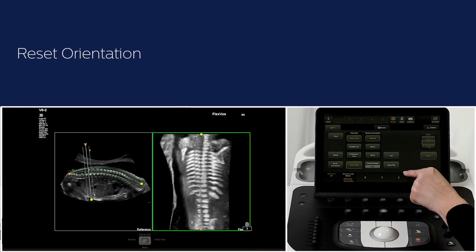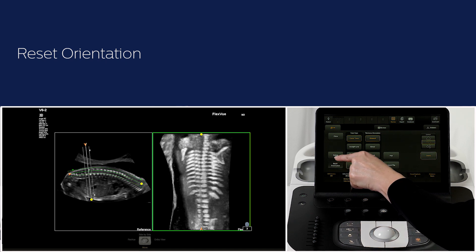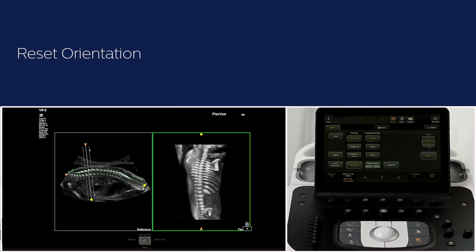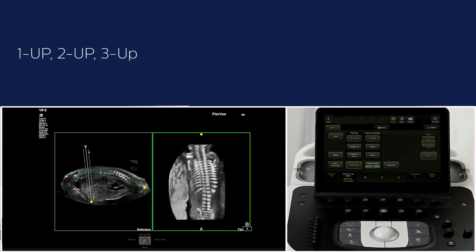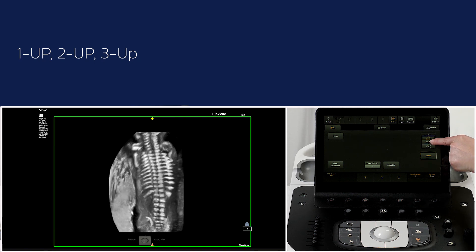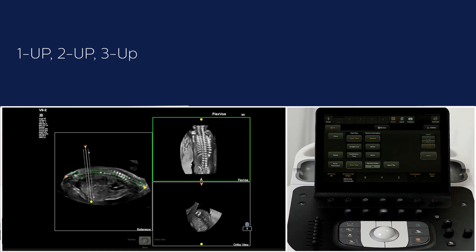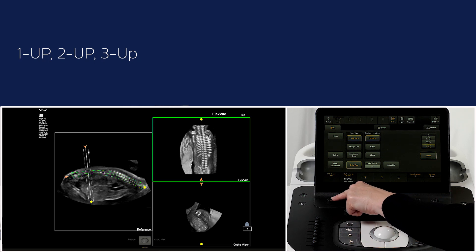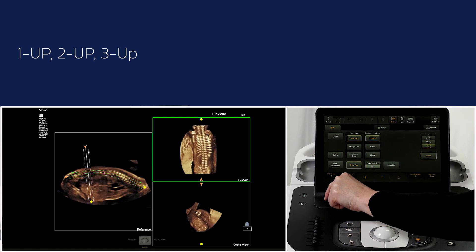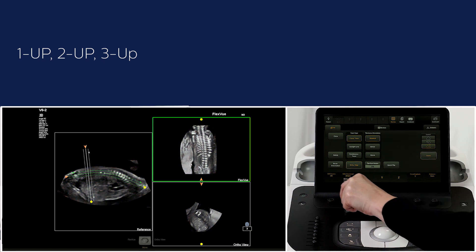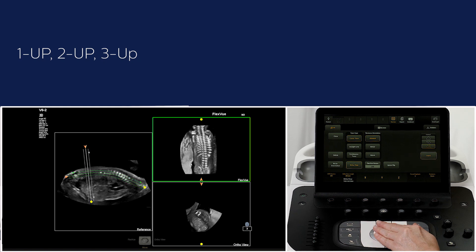Reset orientation will bring the user back to the original FlexView trace and default rotate position. Once the preferred image is achieved, you can select one up, two up, or three up on the touchscreen. Three up will display the reference image, the FlexView image, and the ortho view. Note that the chroma map can be changed at any time. Here you still have the possibility to toggle between the FlexView and ortho view to change the position of the lines.